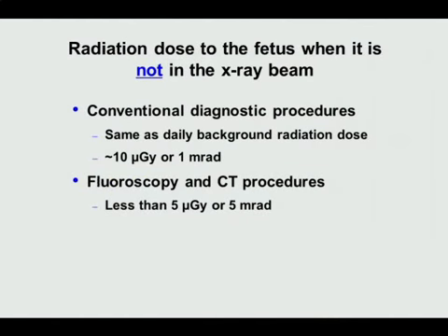Therefore, this is one thing which I normally use when I get questions from the emergency room physicians about what they should do about the patient when they know that the patient is pregnant and they want to take a radiograph or X-ray procedure. The first question I ask is, what is the primary area the X-ray beam is going to fall on?